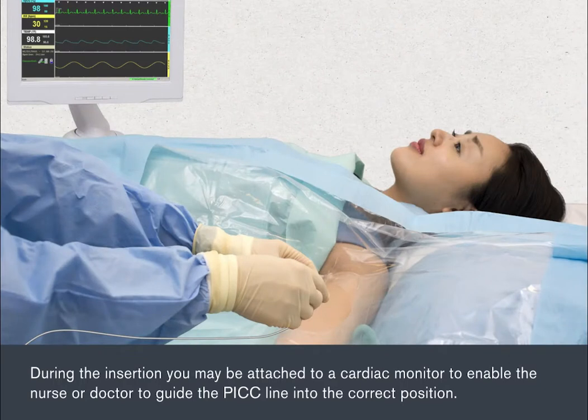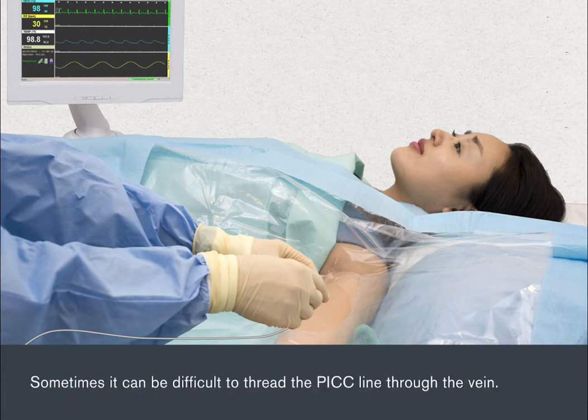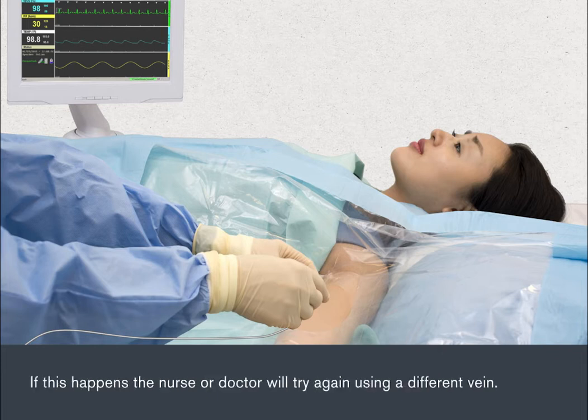During the insertion, you may be attached to a cardiac monitor to enable the nurse or doctor to guide the PICC line into the correct position. Sometimes it can be difficult to thread the PICC line through the vein. If this happens, the nurse or doctor will try again using a different vein.